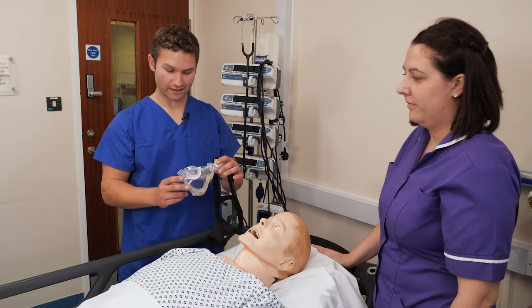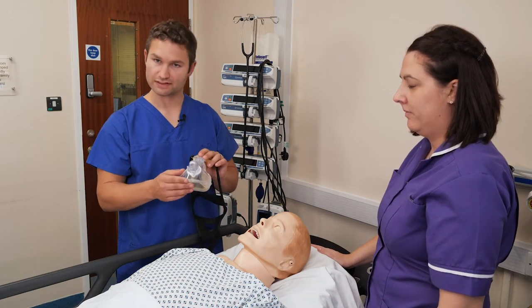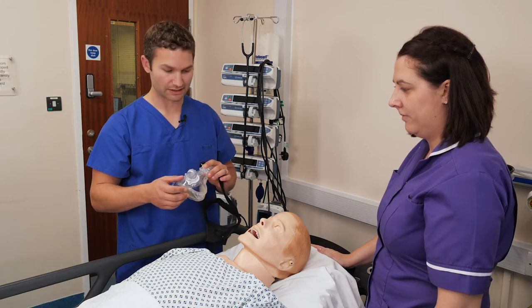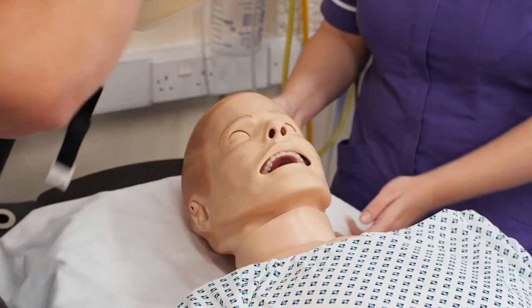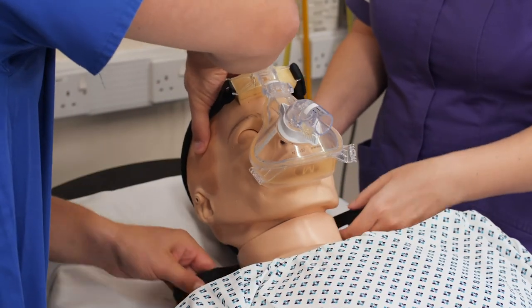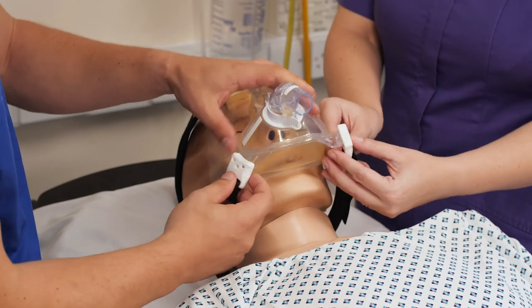This time I'm going to fit an oral nasal mask. This mask has a smaller surface area so it tends to impinge on areas such as the bridge of the nose and the chin. We're going to place it centrally over the nose and the mouth and then bring the straps underneath the patient and clip in at each corner.